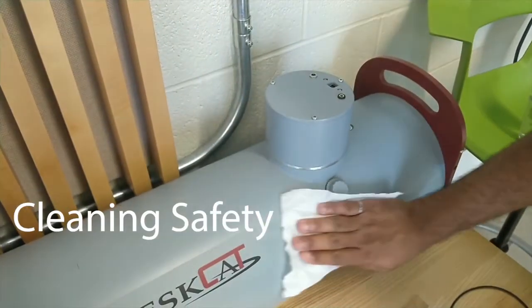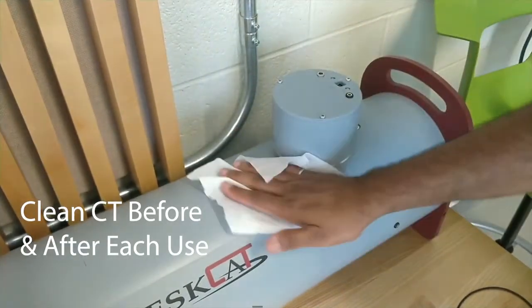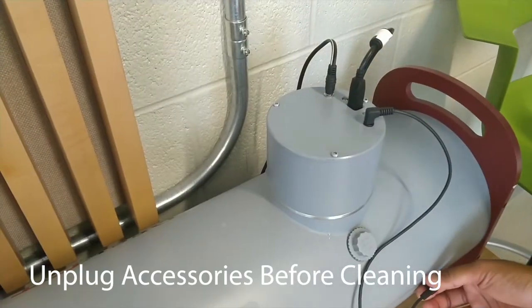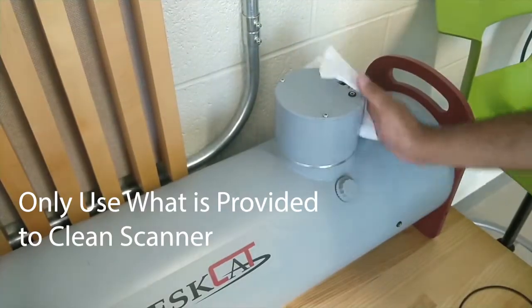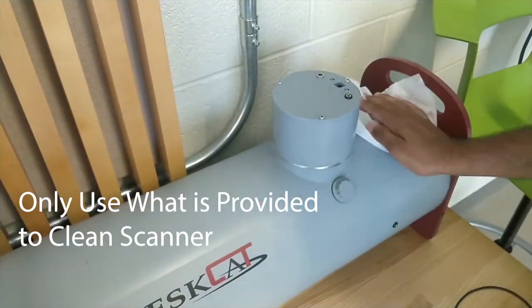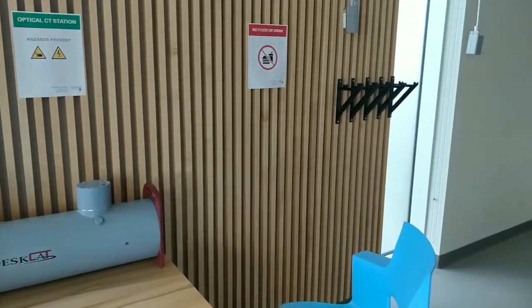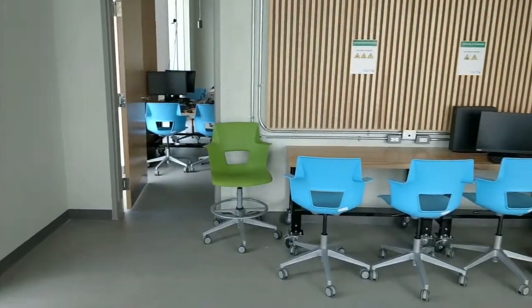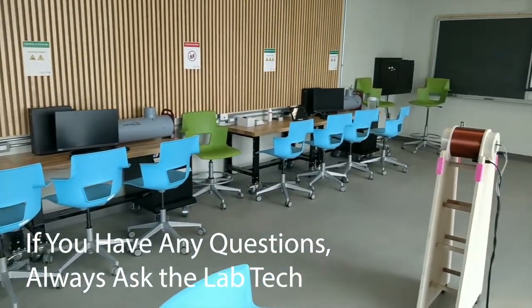Now we will be going over cleaning safety. It is expected that you clean the scanner and its accessories before and after use. Always unplug the accessories from the power or remove the cables from the scanner before cleaning. Only use water or detergent provided to clean the scanner and its accessories. If you follow these instructions throughout your time in the imaging lab when using the CT scanner, you will have a safe and enjoyable learning experience. If you have any questions, always ask the lab technician.